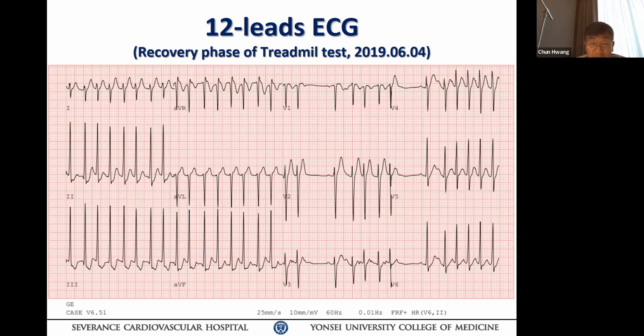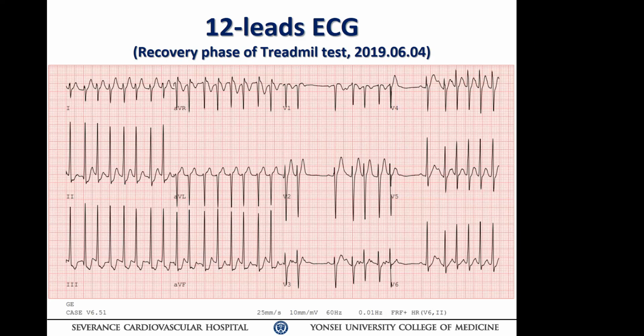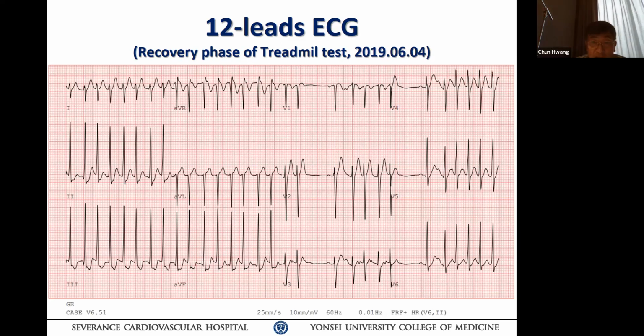So this EKG suggests that this patient may have 2 different tachycardia mechanisms. One would be maybe leftover delta wave tachycardia, AVRT, which is terminated with a P wave. The other one looks like a focal mechanism.